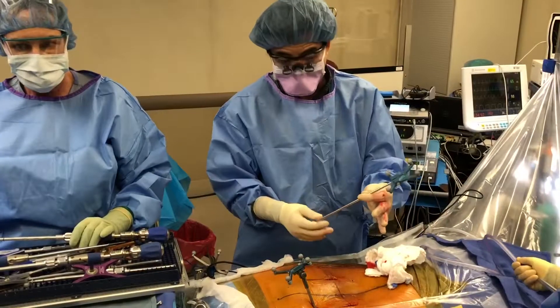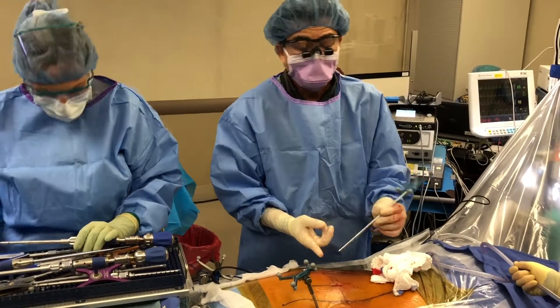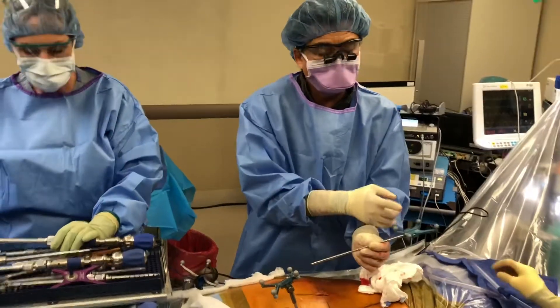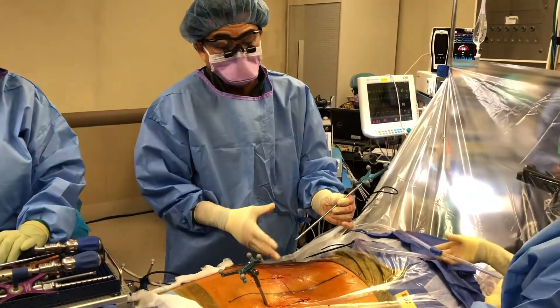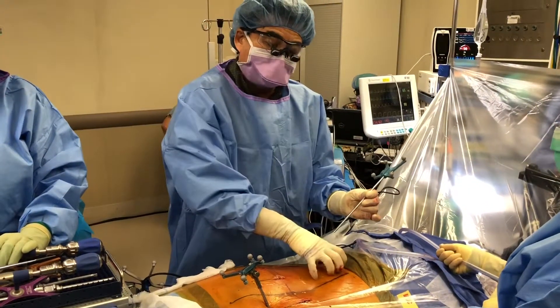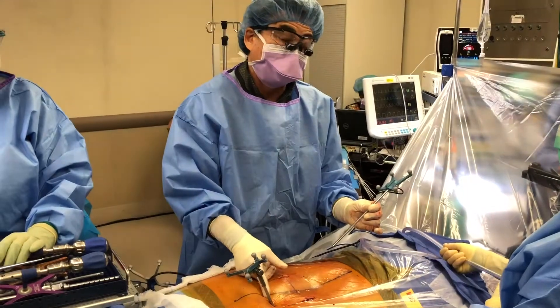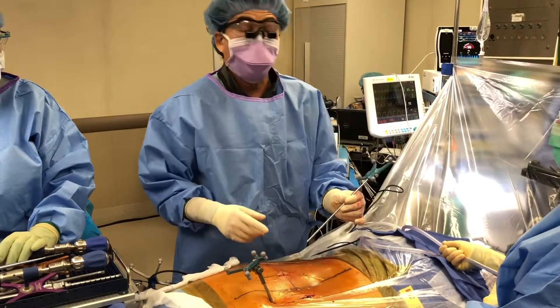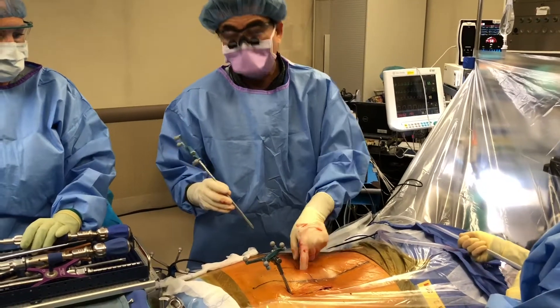The second step is probably even more important than that, because even though this and this is calibrated, we have to make sure that the relationship between the spine we're operating on and where this pin is — which is in the iliac crest, not in the spine — that relationship hasn't changed. This is where we do the intraoperative confirmation.